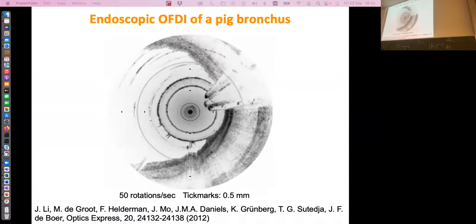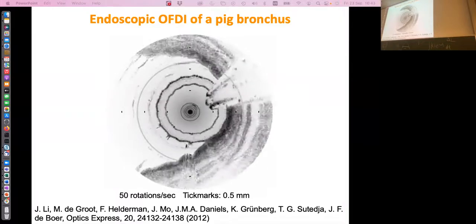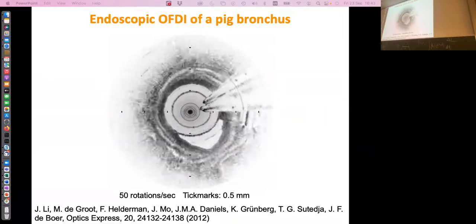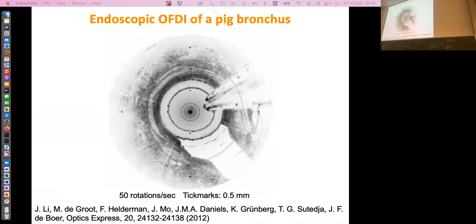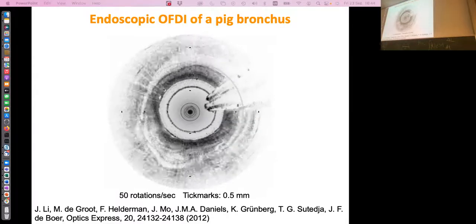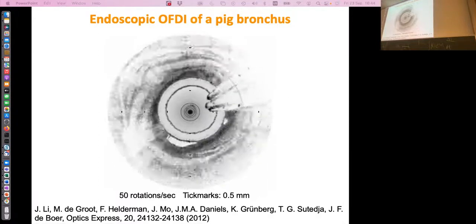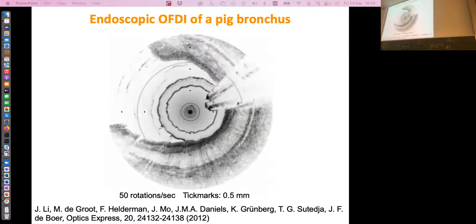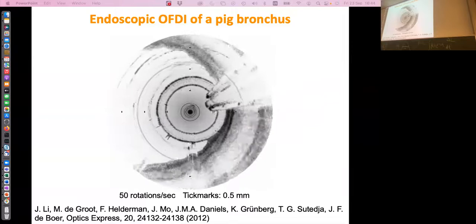The problem with OCT for cancer detection is that you have many things that can change the level of scattering, so it can be a detection of cancer, or it can be a benign growth. So how do you discriminate something that's benign from something that is malignant? That is really the challenge for OCT, and I don't think OCT by itself will be able to solve it. It allows you to see the structural information very nicely, but for tumor detection, you need more. There you get too many false positive warnings because of abnormalities in the tissue.